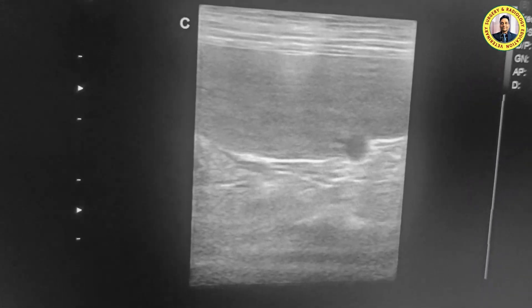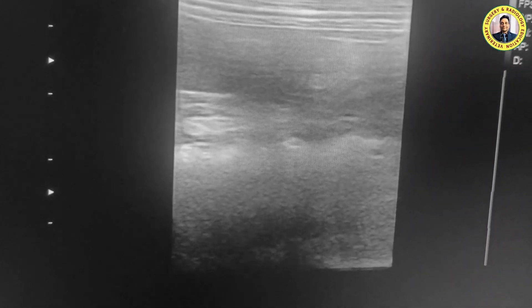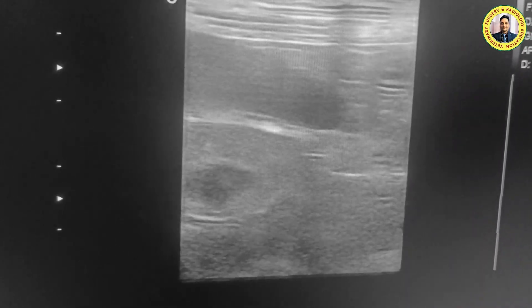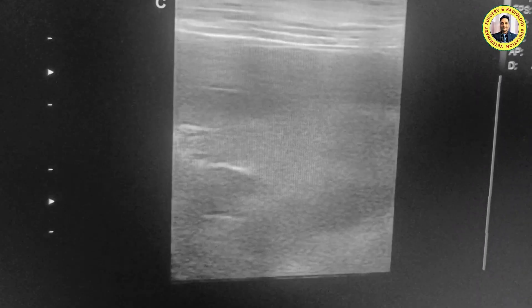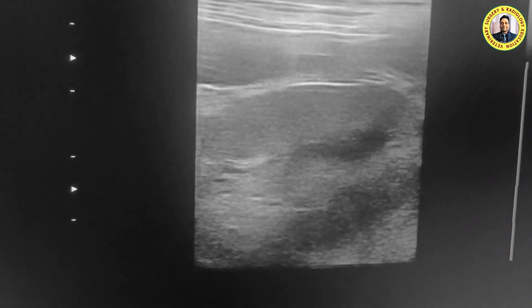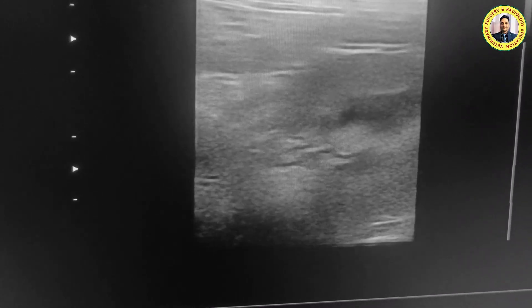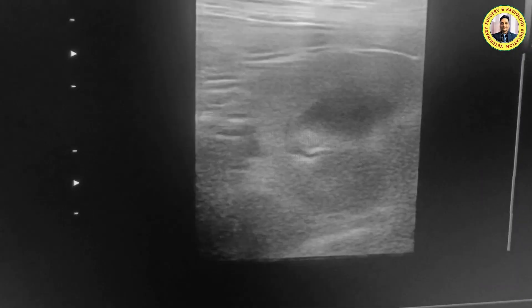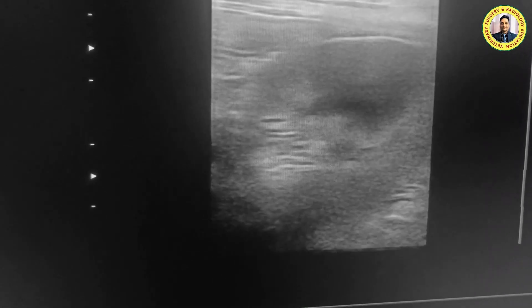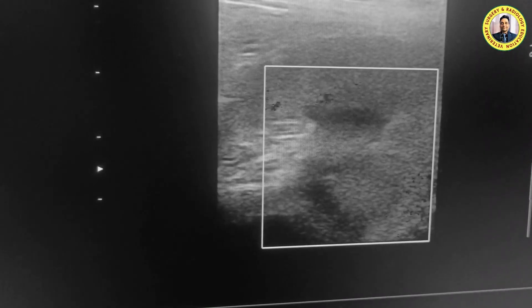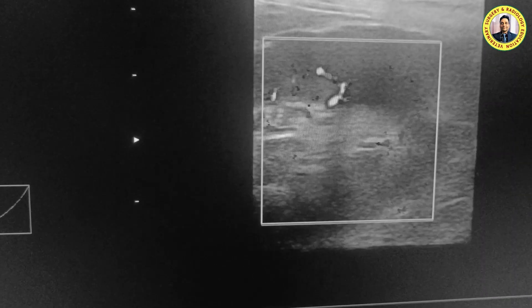Now you can see the left kidney clearly. The blood supply to the area also appears good.